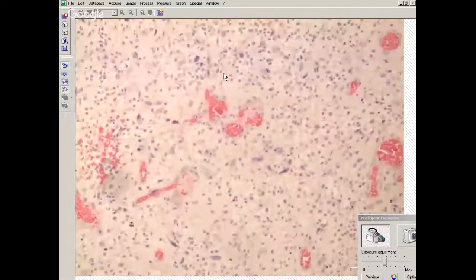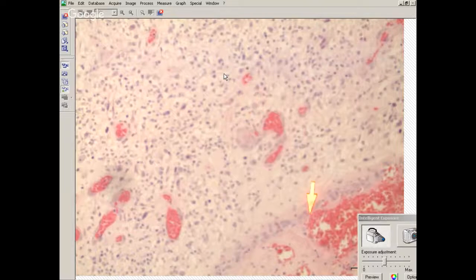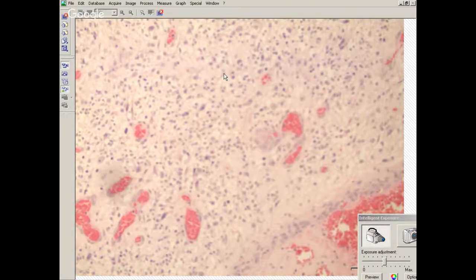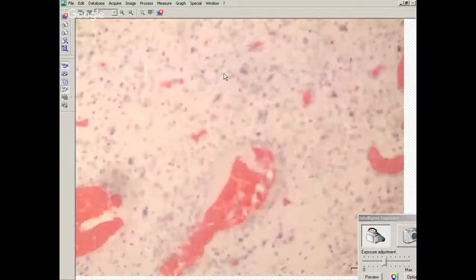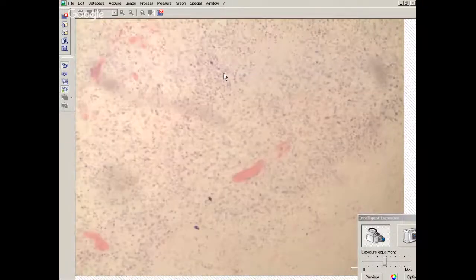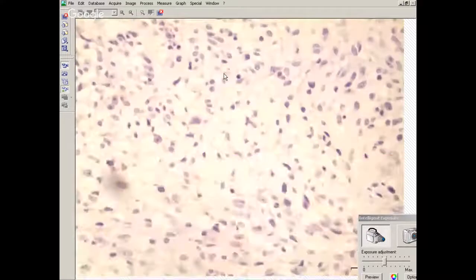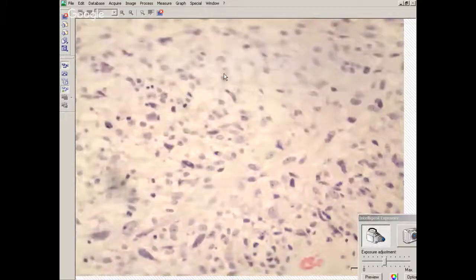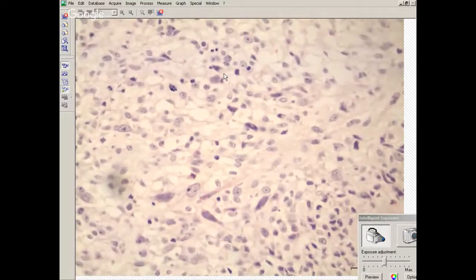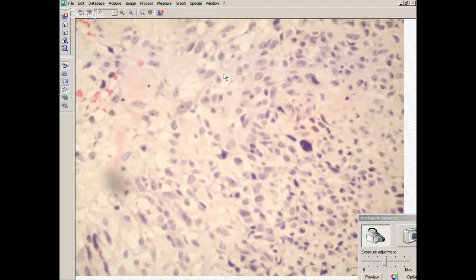It's an atypical proliferation of vessels. Sometimes they can be glomeruloid-like proliferation of blood vessels, where you have multiple lumina within the center of a large blood vessel, where it looks almost like a glomerulus. Those are all endothelial changes that are indicative of a high-grade glial neoplasm, if it's a glial tumor. And then if we look at the tumor cells, they have an elongate, irregular nucleus. Some of the nuclei are very hyperchromatic. The hyperchromatic, irregular nuclei are all indicative of an astrocytic tumor. Here's hyperchromatic, irregular, enlarged nuclei.